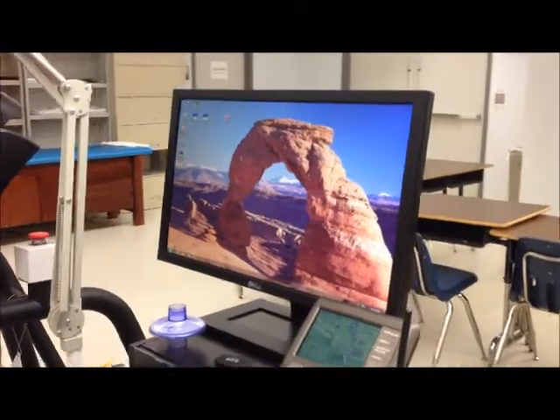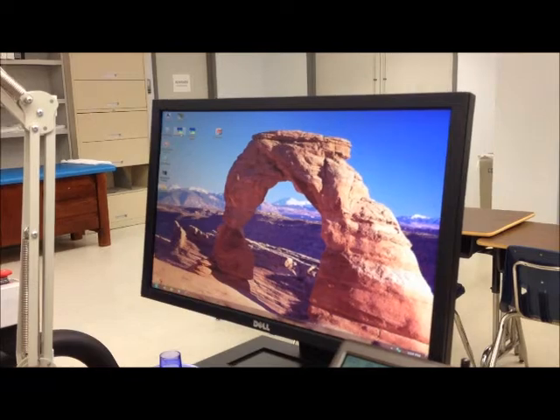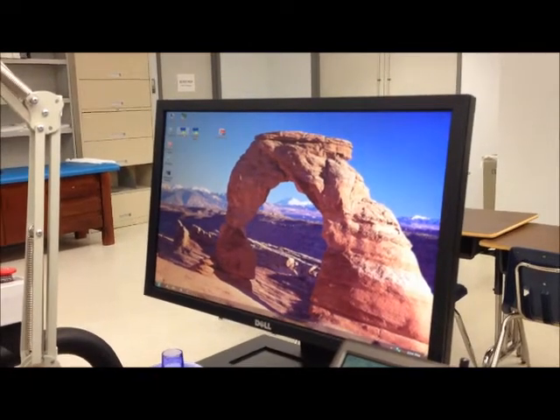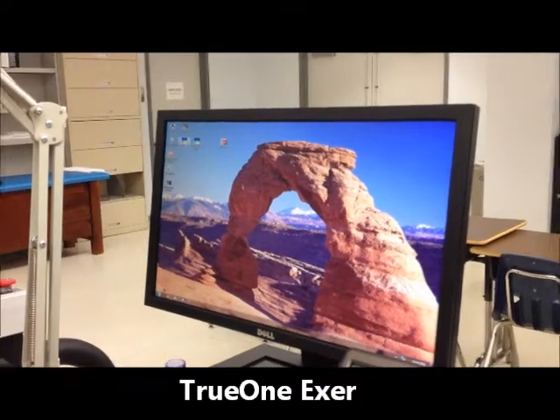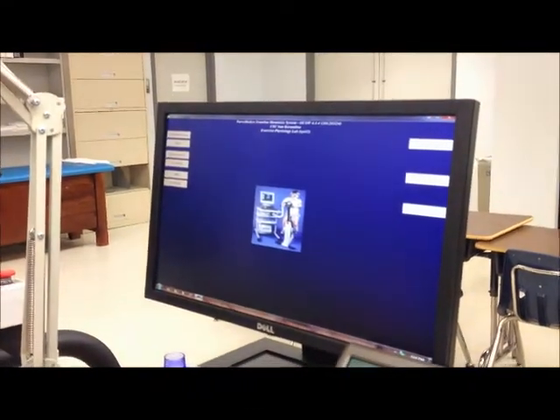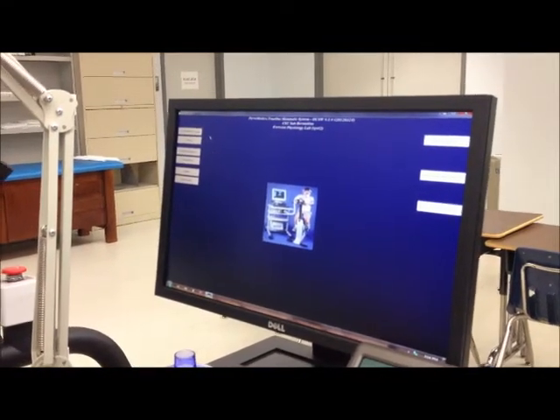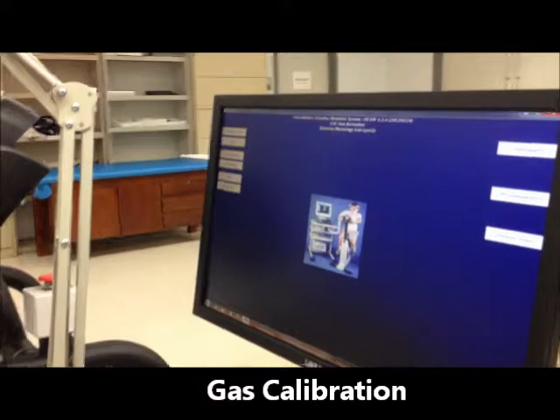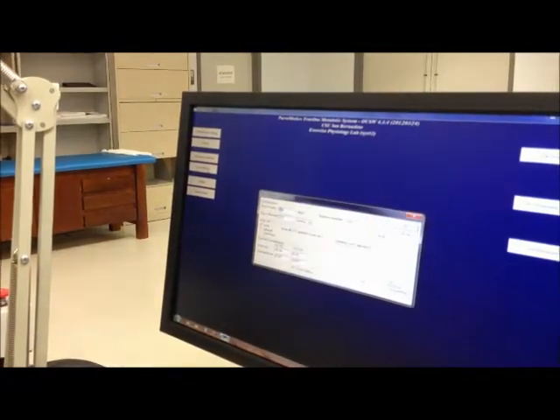These are the instructions for calibrating both the flow meter and the gas analyzers for the Parvomedics. The first thing you want to do is click on TrueOne. For an exercise test, we want to click on TrueOne exercise. This is the main screen for Parvomedics, and the first thing we're going to do is gas calibration, so click on gas calibration.